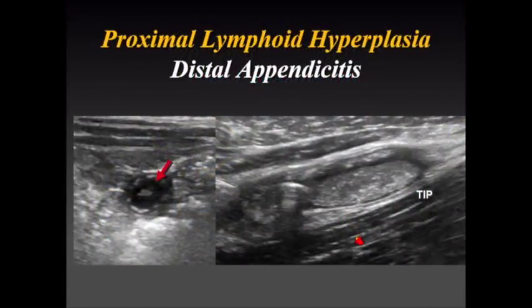And finally, just another example of distal tip appendicitis, marked thickening of the lamina propria obliterating the proximal lumen. And there's distal, both echogenic fluid and gas at the tip. Again, we're seeing this in an LPO position because it was a retrocecal appendix. Notice that there's some gas in the appendix, and seeing intraluminal gas in the appendix may or may not be acute appendicitis. If there are secondary signs of appendicitis, it may be a gas-forming infection. So here's an example of distal appendicitis related to lymphoid hyperplasia.